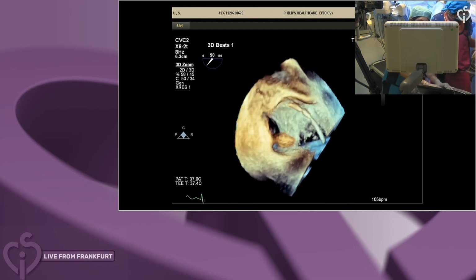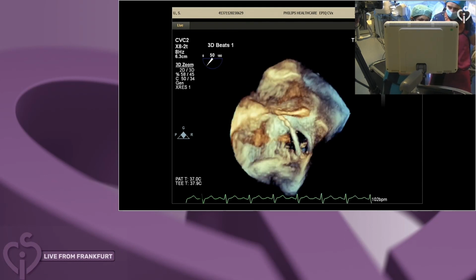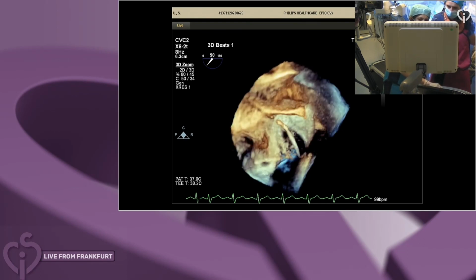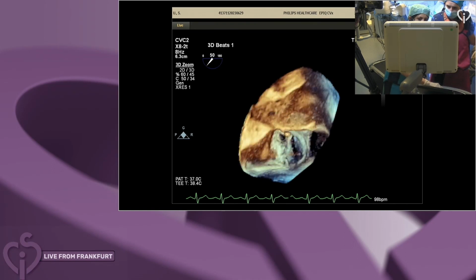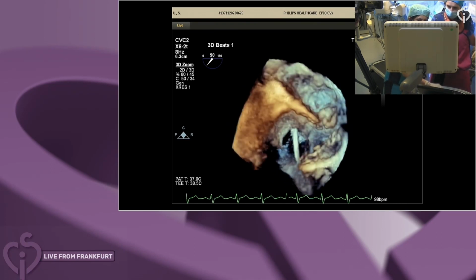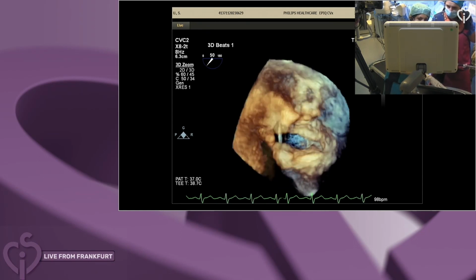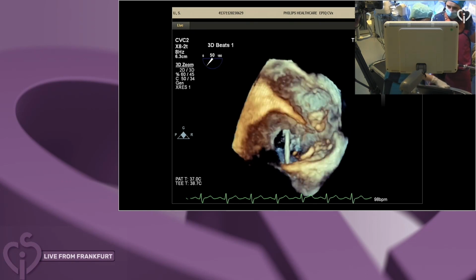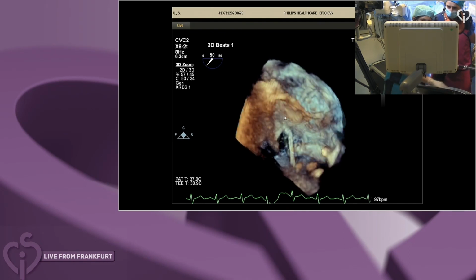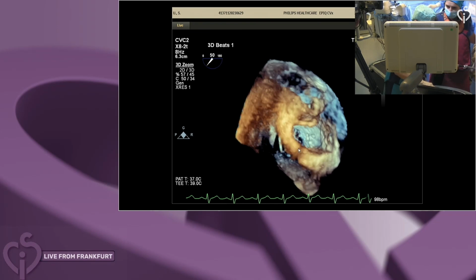But the septum looks a little bit aneurysmal. So you can see fossa ovalis, quite an aneurysmal septum. The wire's bouncing around, but with the wire through, that's the measurement we got, maybe 12 millimeters. And then you can see that there's also a eustachian valve. You can see the fossa from the right side, and there's this thing flicking around here. There's quite an extensive eustachian valve in this case as well.